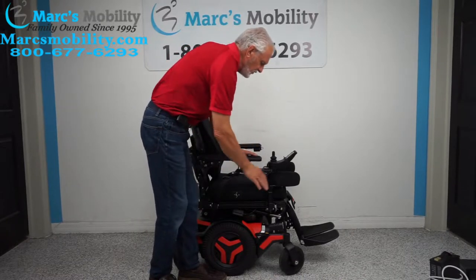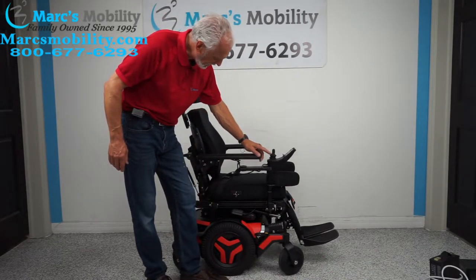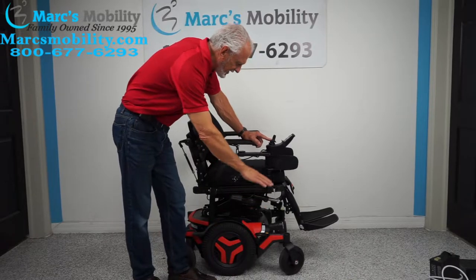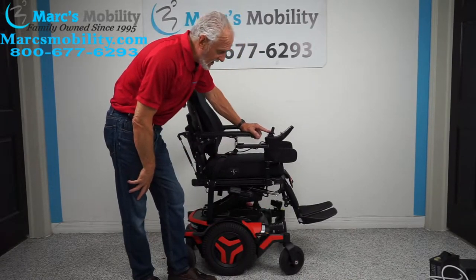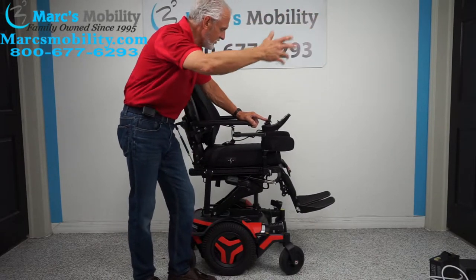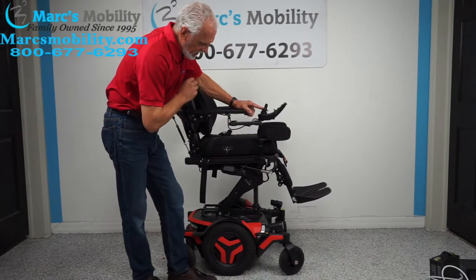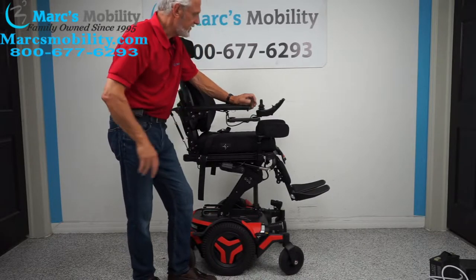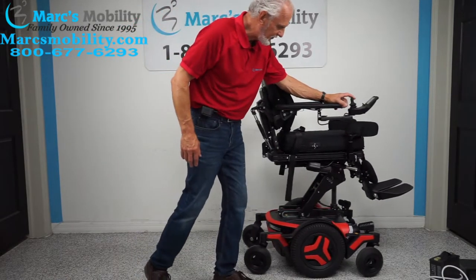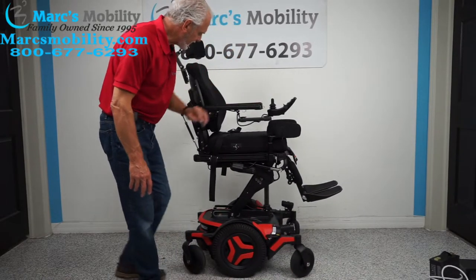Right now the seat is yellow, so I can go back and forth with the joystick to make the seat go up. We're going to start at 22 inches and by the time it's all the way up, you'll be at 34 inches high. This is great if you want to do your dishes, grab something out of a cabinet, or go to a movie and see above everybody else. The nice thing about the seat lift is you can still drive this chair at 3 miles an hour with the seat lift elevated.